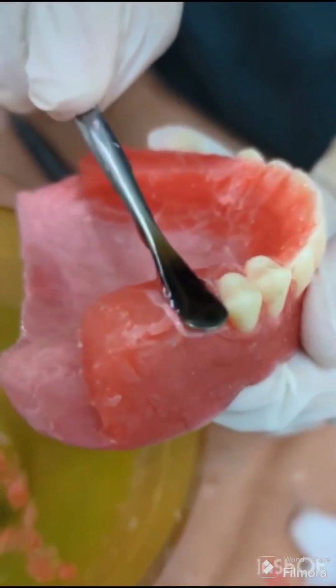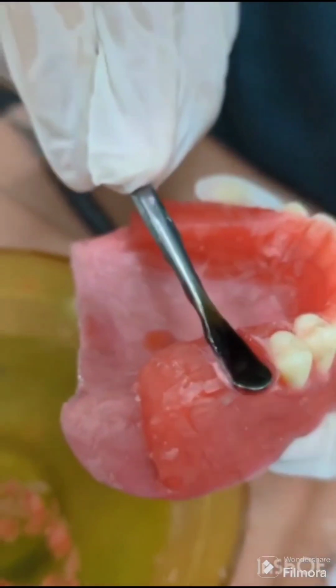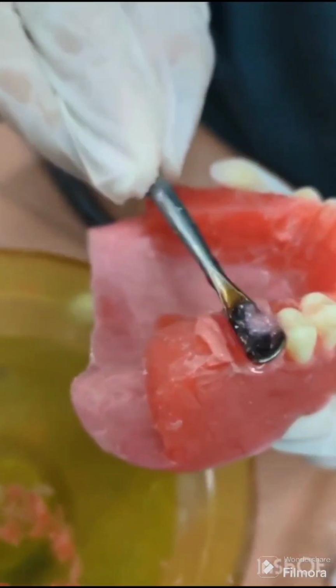Now moving to the arrangement of the maxillary first molar. When viewed from the front, the long axis slopes buccally. When viewed from the side, the long axis slopes distally.